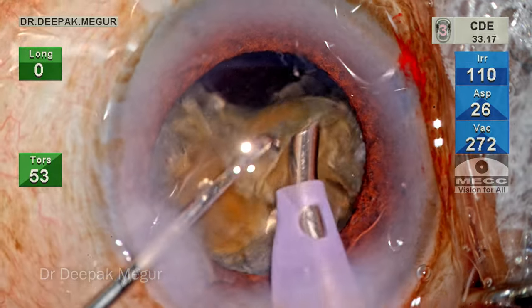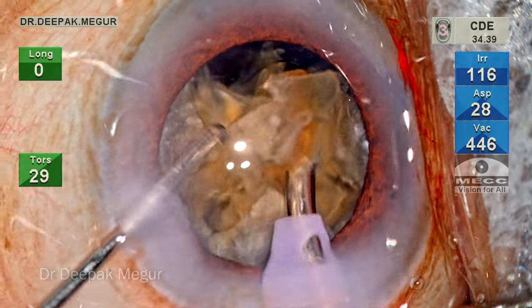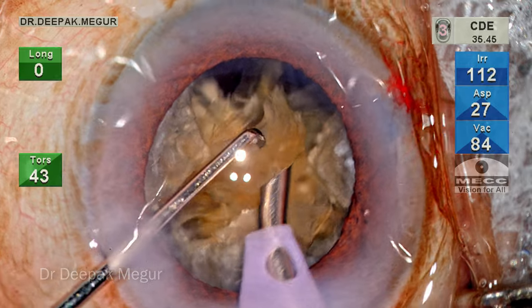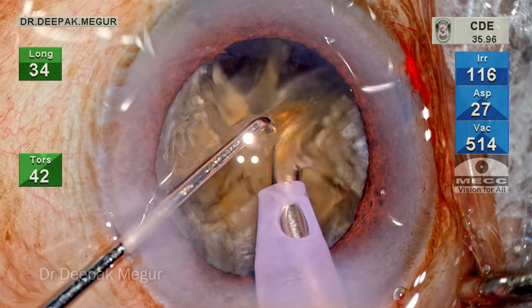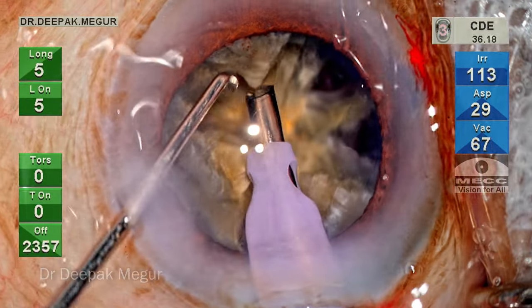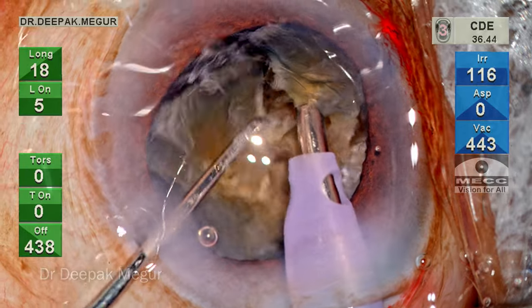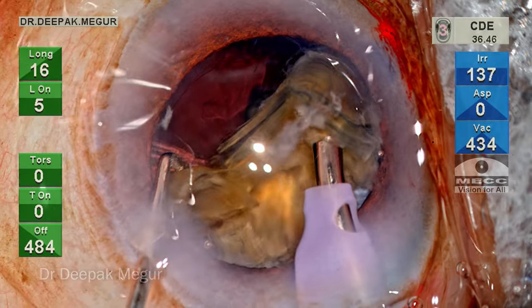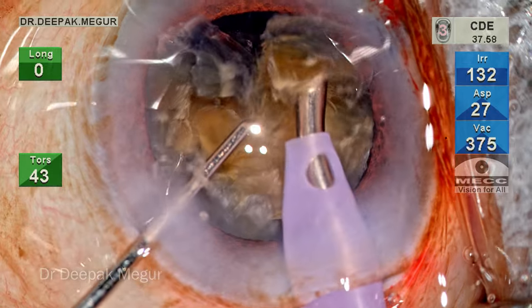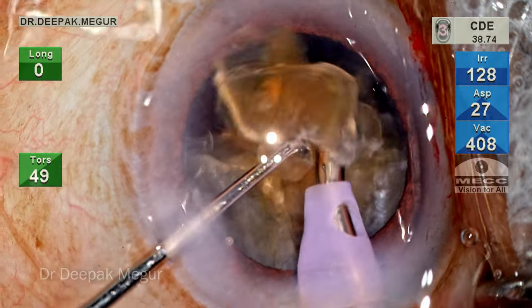I phaco this one fragment out. The second part of the same fragment is then emulsified. The pedicle of attachment is cut off and is still hanging adjacent to the posterior plate — that's fine, it's not going to be much of an issue. Going in with the second fragment, I'm going to divide this into two pieces. Even a wide lateral separation maneuver is not going to separate the posterior plate attachment, so I try to chop it — going underneath it and trying to chop at the attached pedicle itself. I am reasonably successful in freeing up this fragment, which is then eventually consumed.